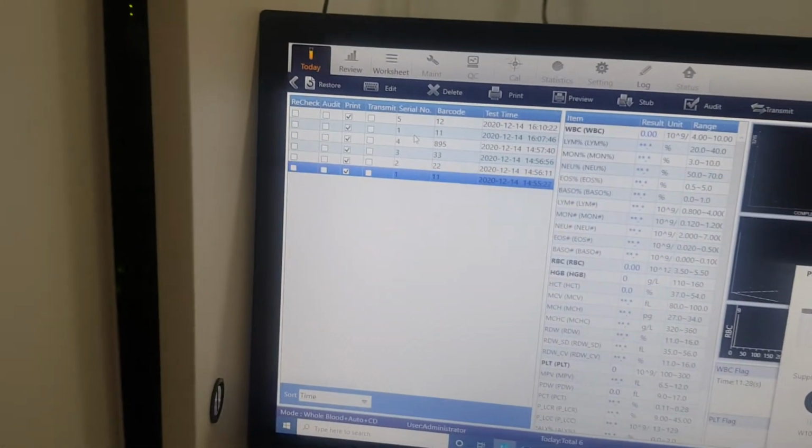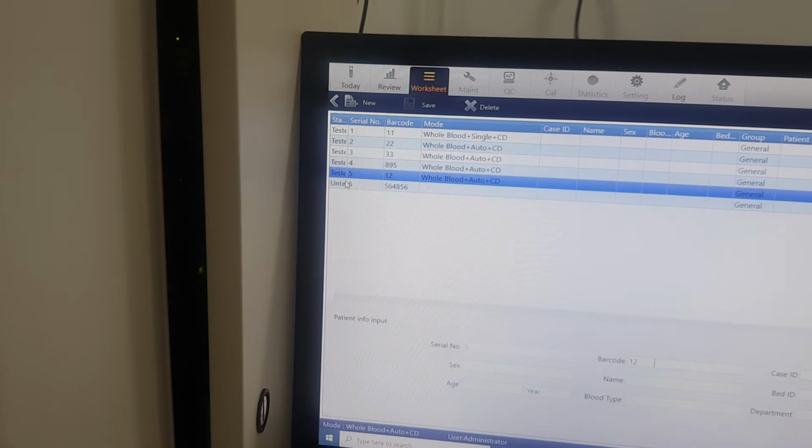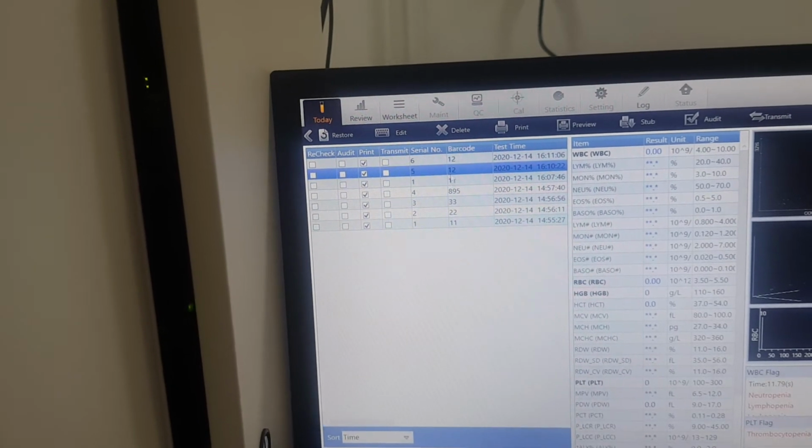See, this is number 5 with barcode number 12, but in the work list we had a different number here with 5. This number is already changed with the analyzer number. Okay, in number 6 we have also 12. See, we have 2 12s.